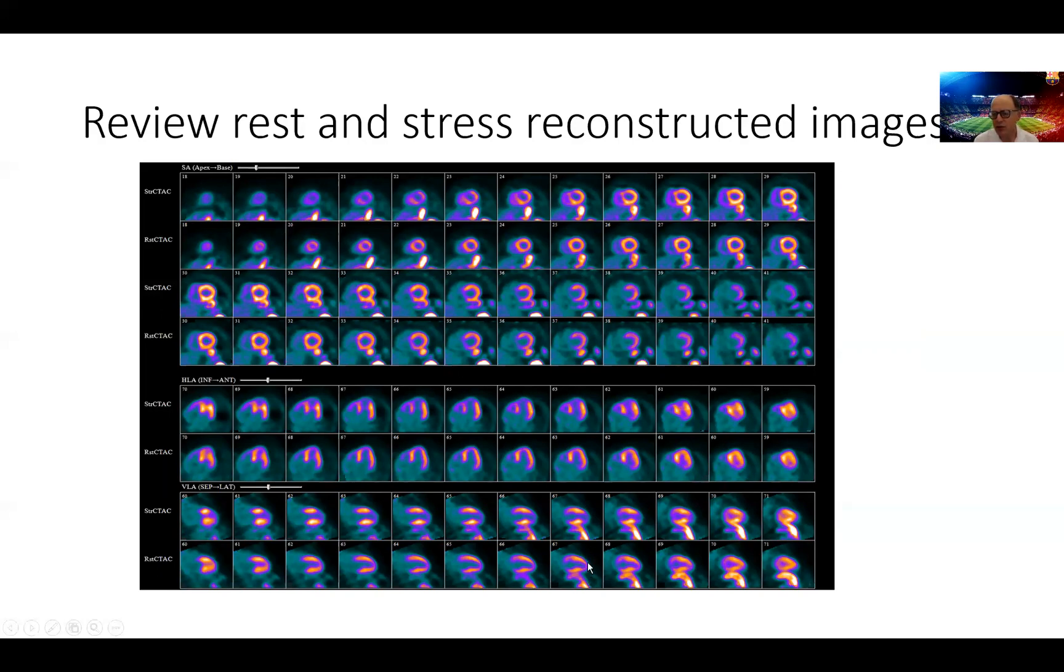In the stress images, we can see right away there is a perfusion defect that's severe, involving the distal part of the left ventricle right here in the vertical long axis.